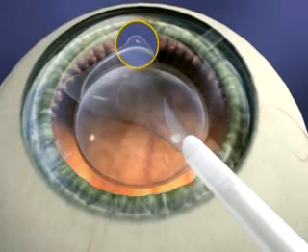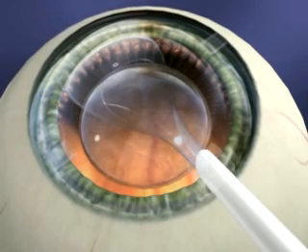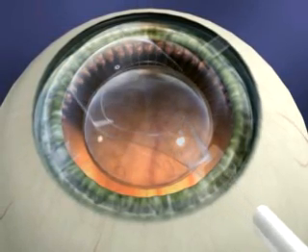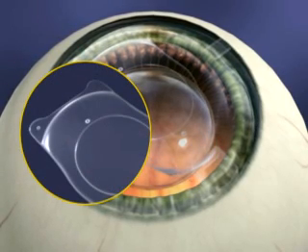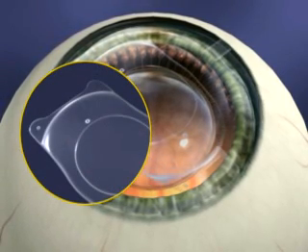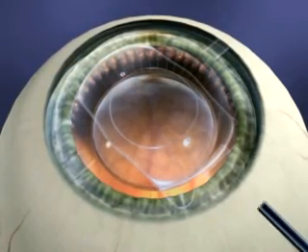Remember, as long as the ICL remains within the cartridge, you still have control of the implantation process. Be patient. If the ICL unfolds with the landmark on the left, it will be delivered upside down and will require removal, inspection and reinsertion.